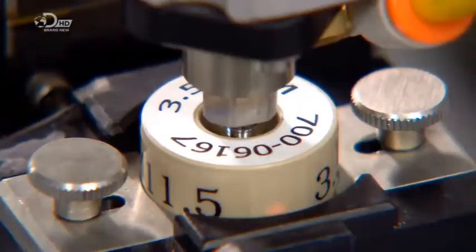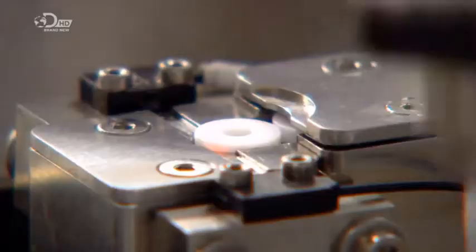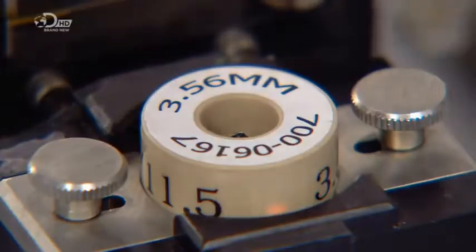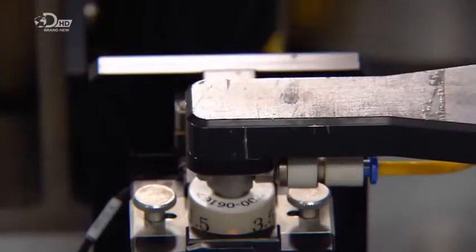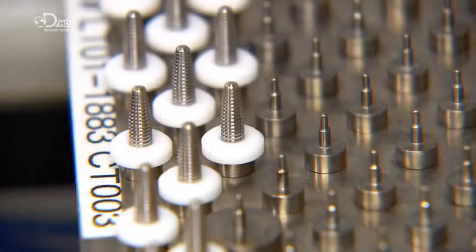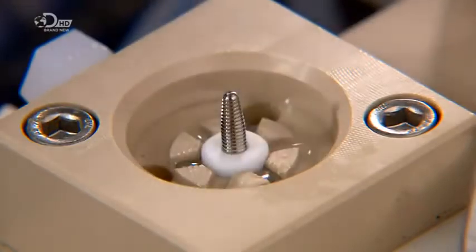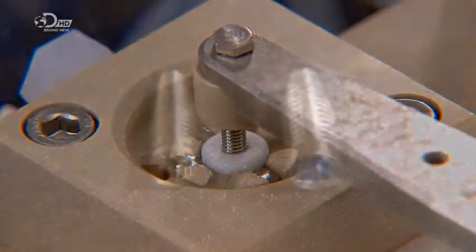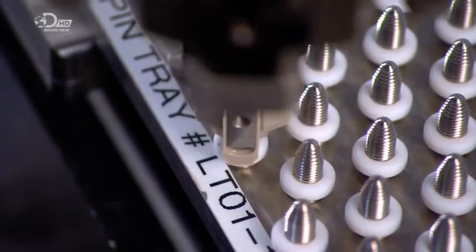An implant is transferred to a holding device, which secures it for the next robot to press a plastic collar onto it. This collar is temporary — it will serve as a mask to protect the outside of the implant as the top undergoes a process of colorization. A robot places the implant upside down in a mild acid, and then an electrical charge is applied. Different colors appear at different voltages to color code the part and indicate the diameter. The process is called anodizing.